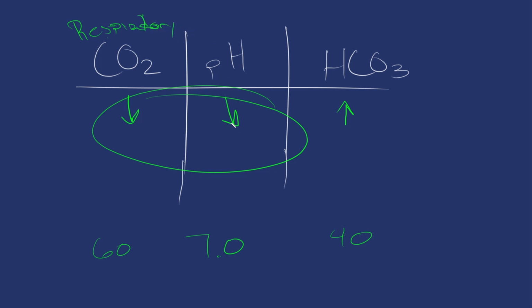And we see this is down, so we're acidic, so we're respiratory acidosis. With, in this case, bicarb has been thrown off here, right? It started going up. So now we have partial compensation. So what's happened is the kidneys have finally reacted, and they're starting to increase the bicarb in the blood to compensate for that CO2 buildup.